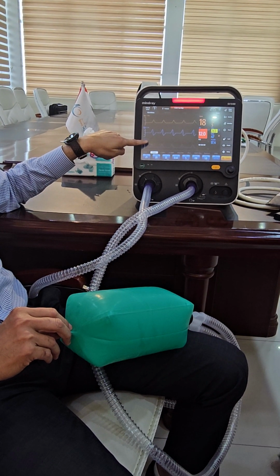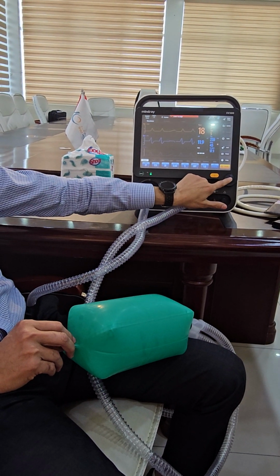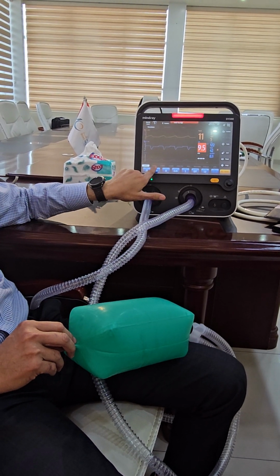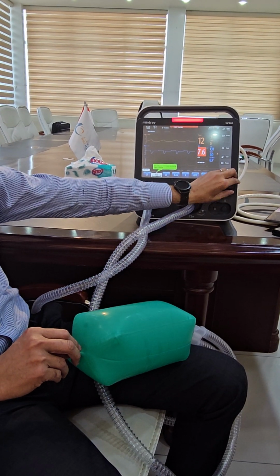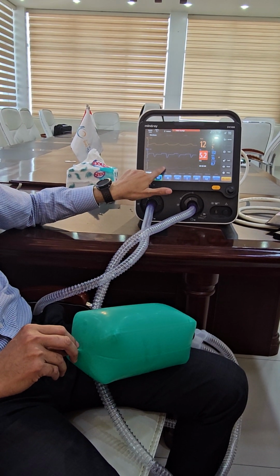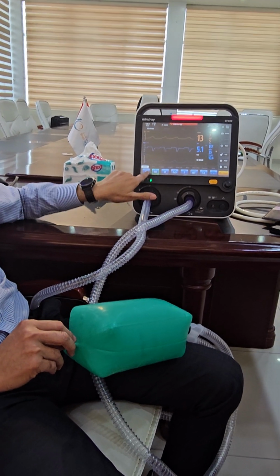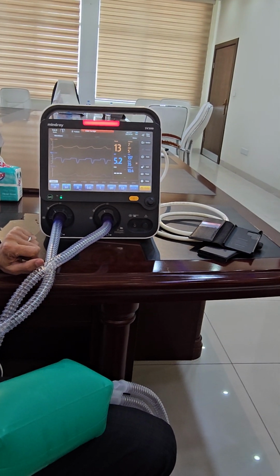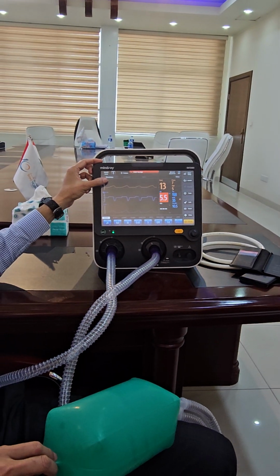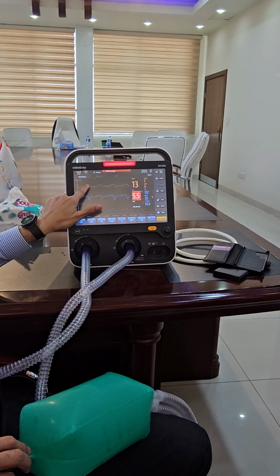Look at the volume when we go to volume control. You see? Because we said let's decrease the volume, but let's increase the volume, so I want you to see more. The volume will increase, and the flow will be higher. Because we're giving volume, we're controlling only the volume, and you can see the pressure.